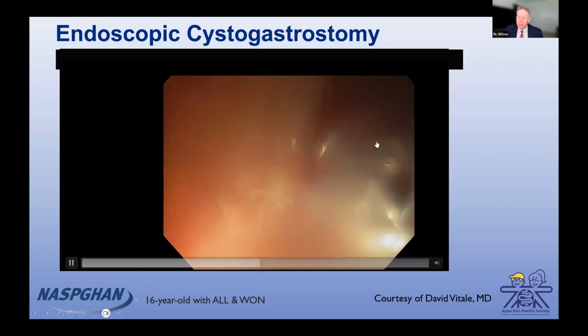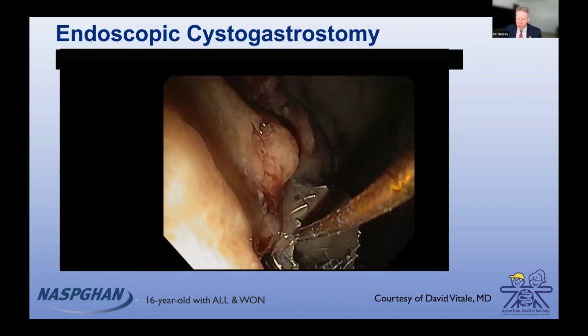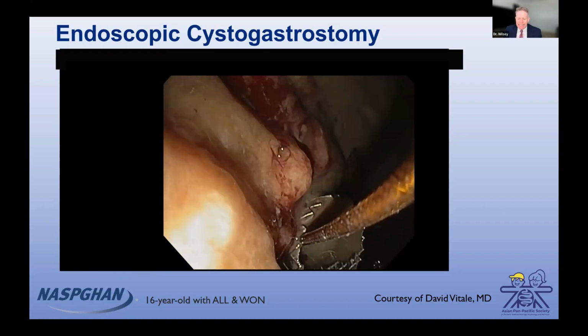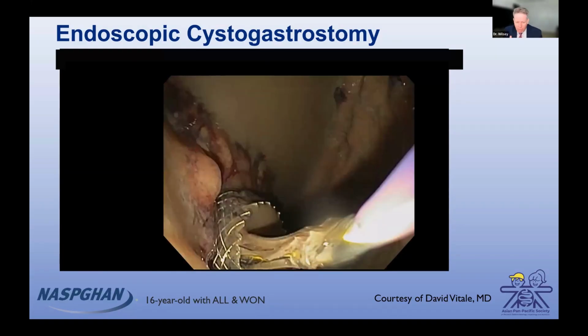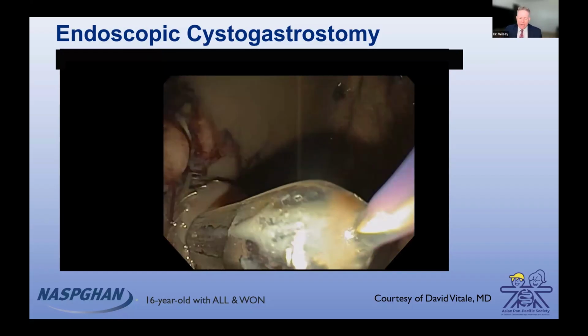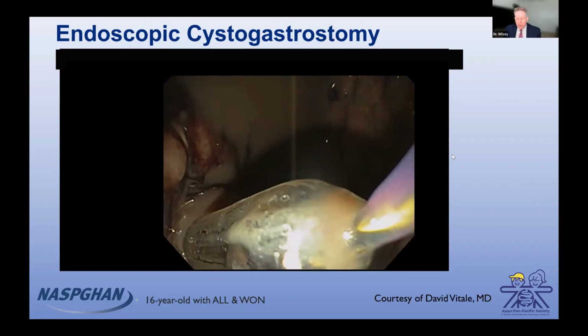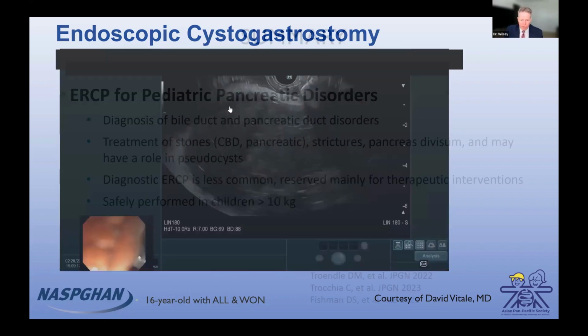And when you are able to start draining this cyst, we'll go ahead and put a balloon to try to open up the cyst. It's so gross, but it's so satisfying. It's like Dr. Pimple Popper, right? It's like lancing an abscess, and it's so satisfying. And so David put in a double pigtail stent as well. On the diagram you can see the lumen-apposing metal stent, this barbell, and then a double pigtail stent to help keep that lumen from occluding, allow drainage.